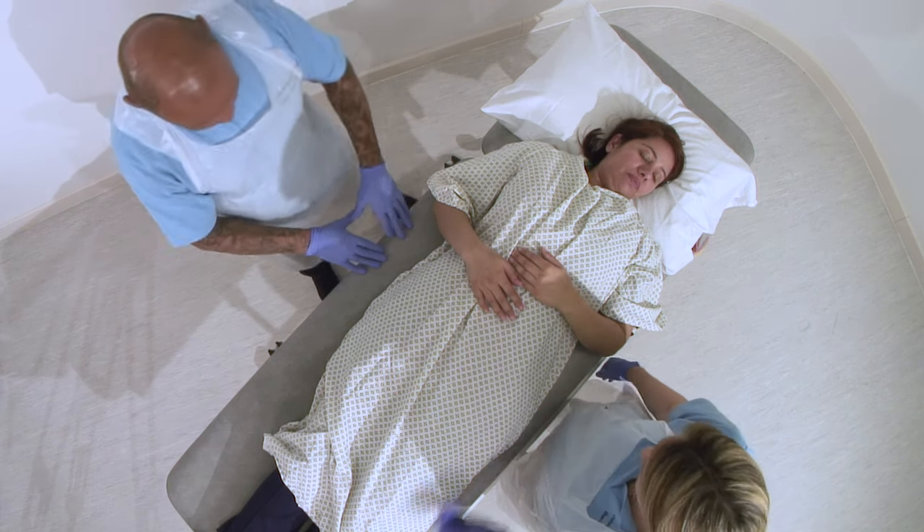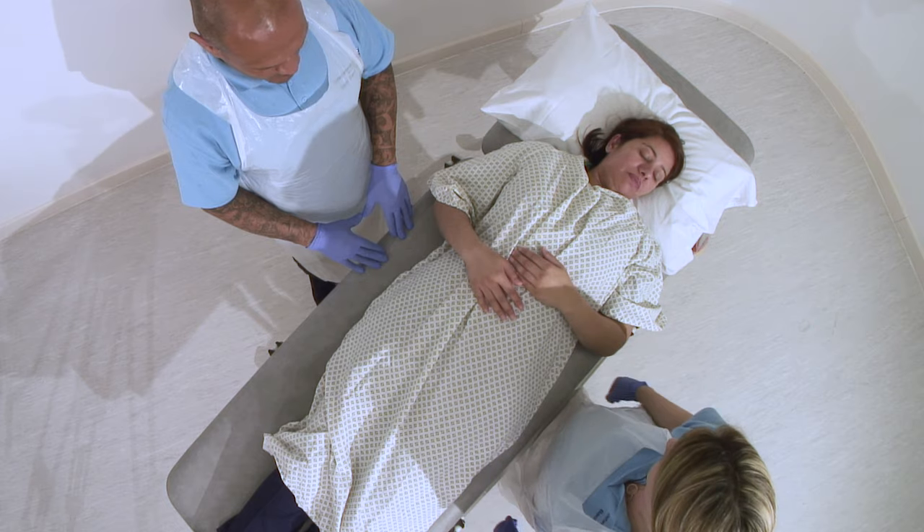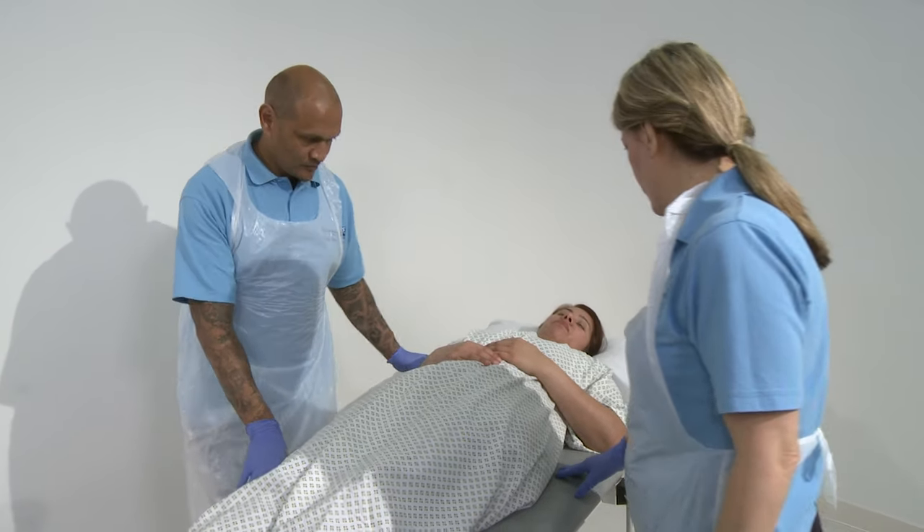Hello Niha, we're going to transfer you up the bed slightly and we're going to give you a hand. I have to roll you over first. I'm just going to bring the bed up to the right height for you.